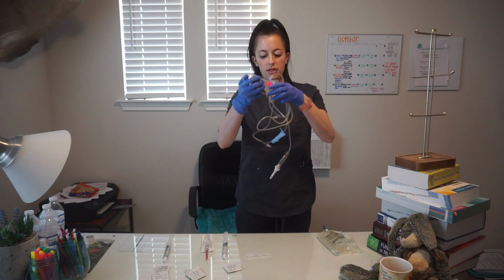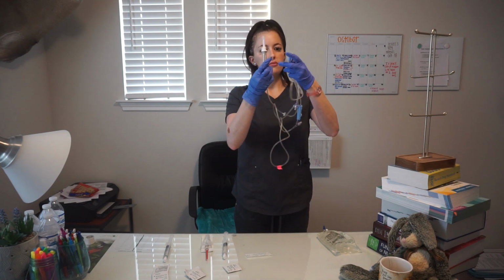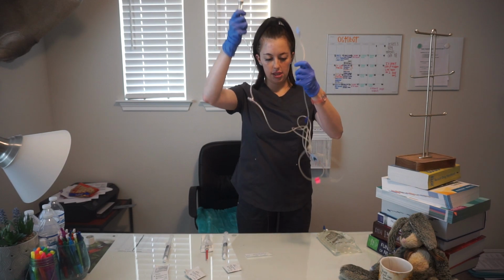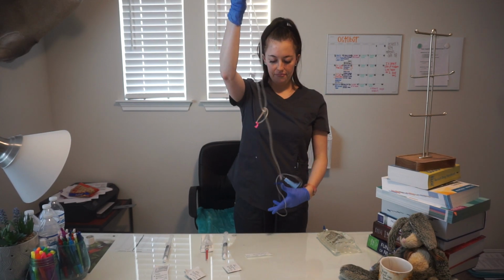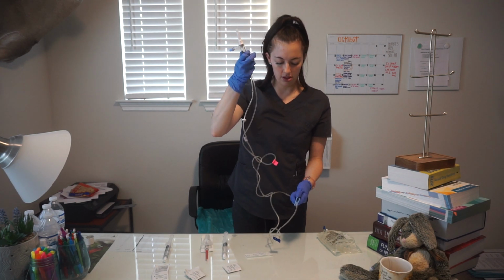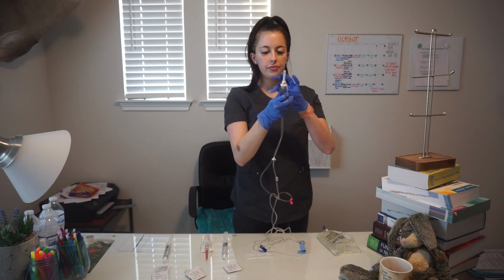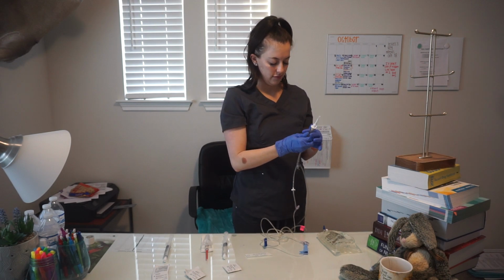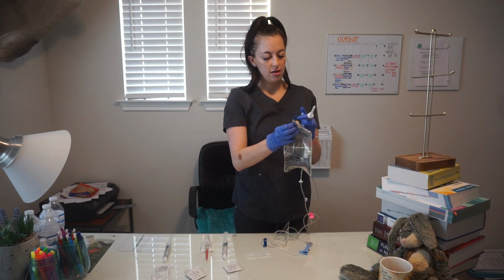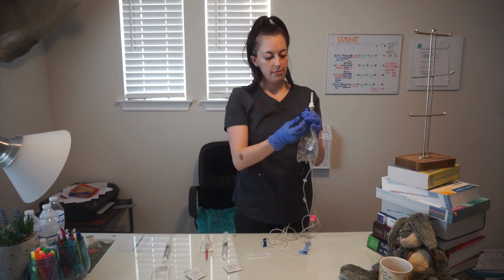Keeping all ends sterile. I'm going to untangle this. Make sure the clamp is closed. Okay. I'm going to aseptically spike the bag.